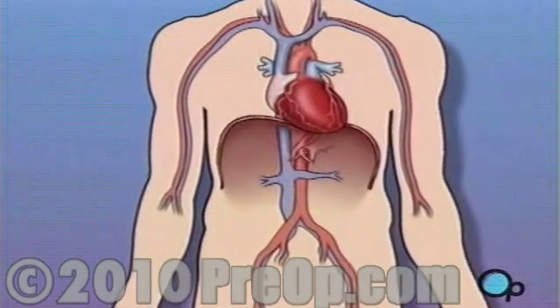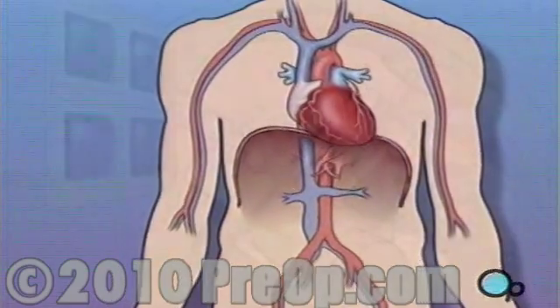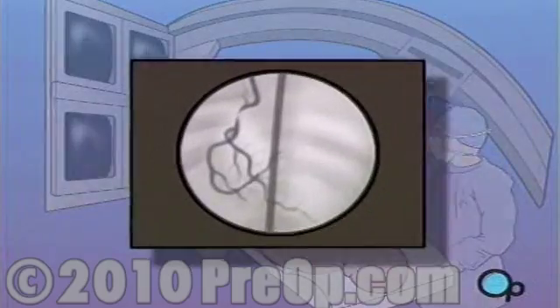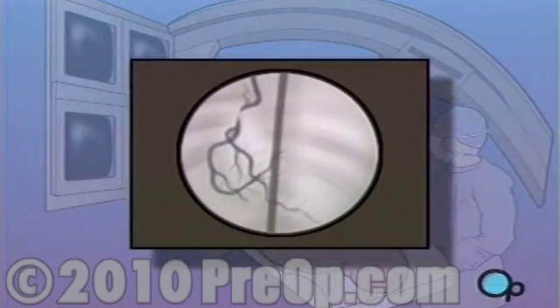During and after the procedure, your doctor will take x-rays in order to monitor your progress.